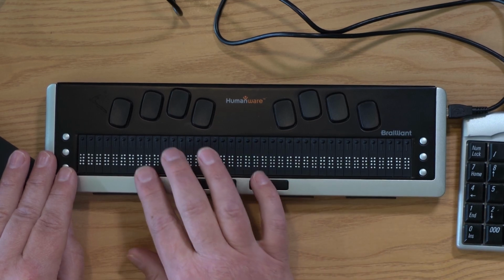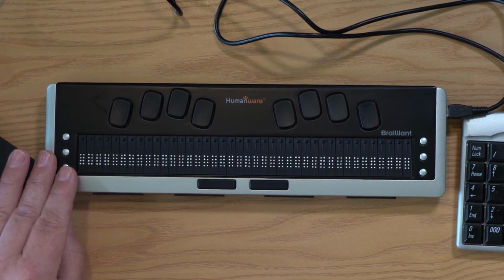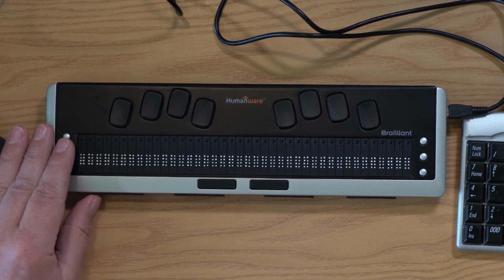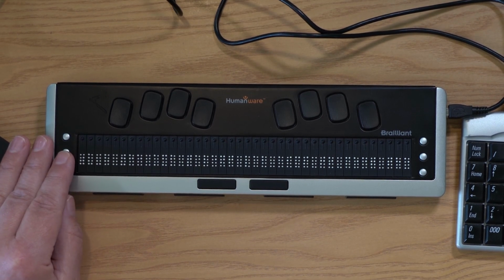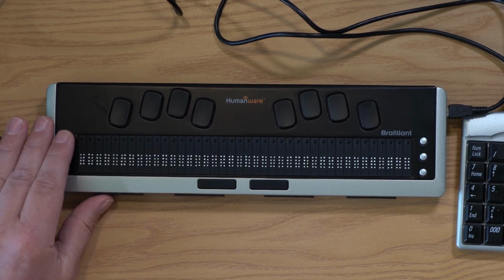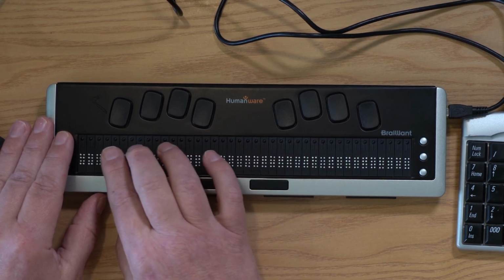Okay, right here, I've got a Braille Display. Very powerful device. There's pins along here that indicate what has focus on the PC. Again, very powerful for someone who maybe would prefer to use Braille instead of speech, or as we've got it set here, Braille with speech. I'm going to move up a line. Heading level 1, innovating the future of digital inclusion. And there's that line we started with before.